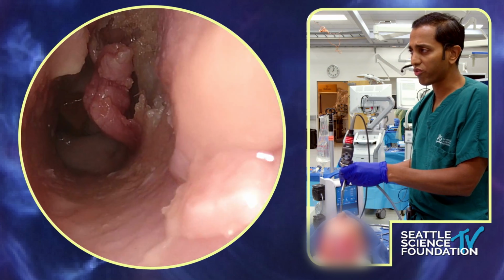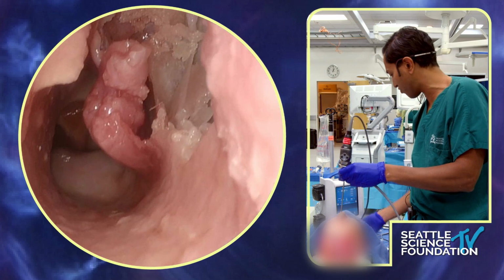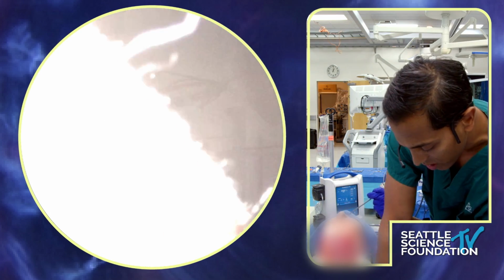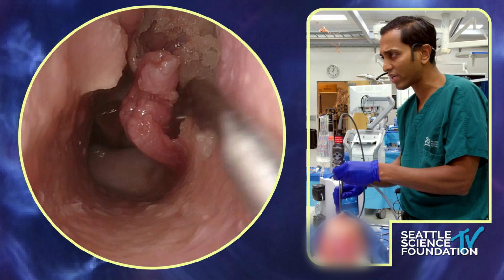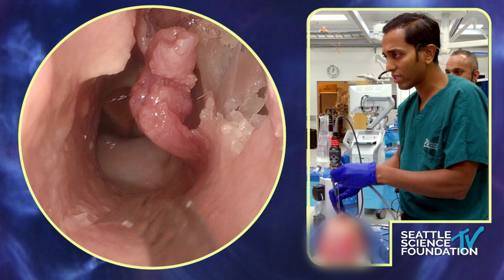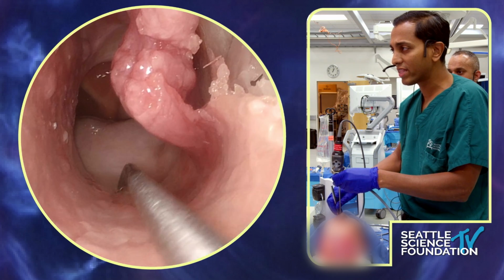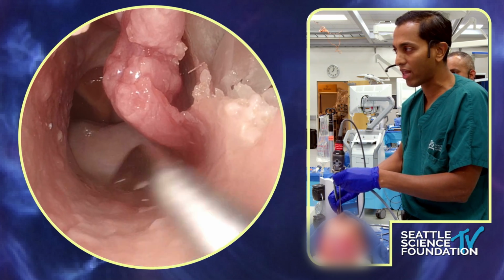I love the floor free grafts. So if we were going to get a floor free graft, it would be down from here. Sickle knife, go. Oh, here, sickle knife. If you're going to get a floor free graft, I came up here a little bit earlier and created this a little bit, but where I like to go is, if you feel back, this is soft palate back here. You don't want to be back there. You want to stay on this hard palate bone here.